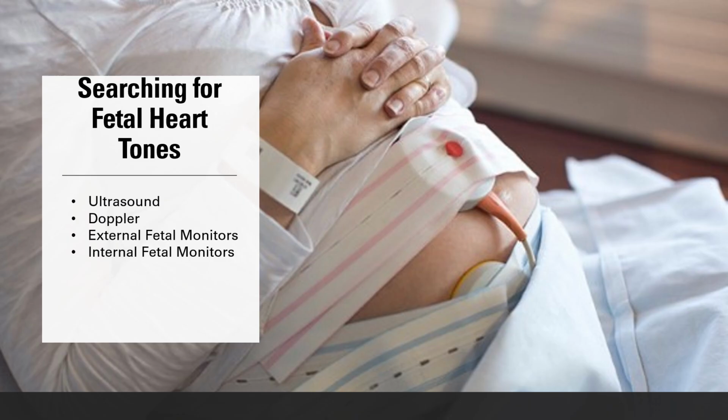There are multiple ways for us to get fetal heart tones. Number one, that can be done by ultrasound. Two, by a Doppler. Three, external fetal monitors. And four, internal fetal monitors. And we're going to discuss that in the next few slides.